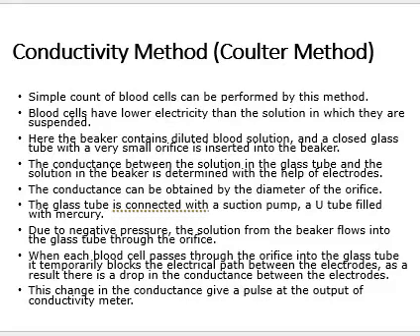When we switch off, it is counted as 1, and again it starts conducting, and when it is turned off again, it is counted as 2.